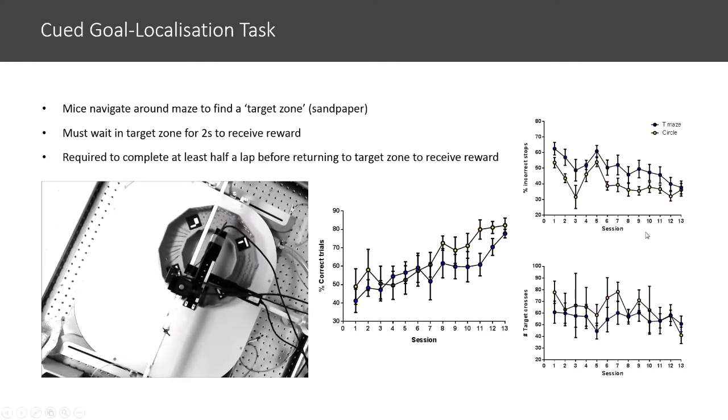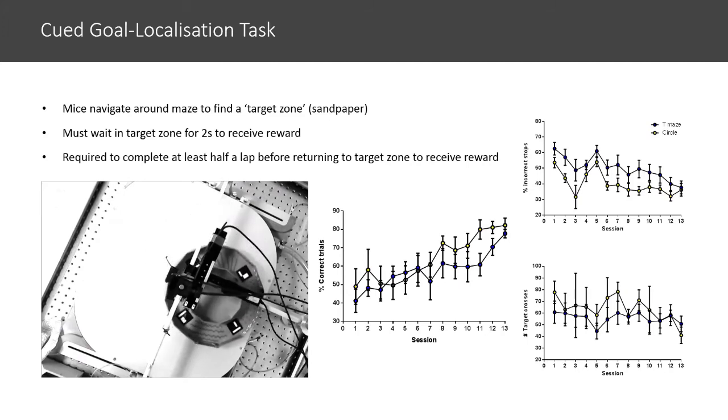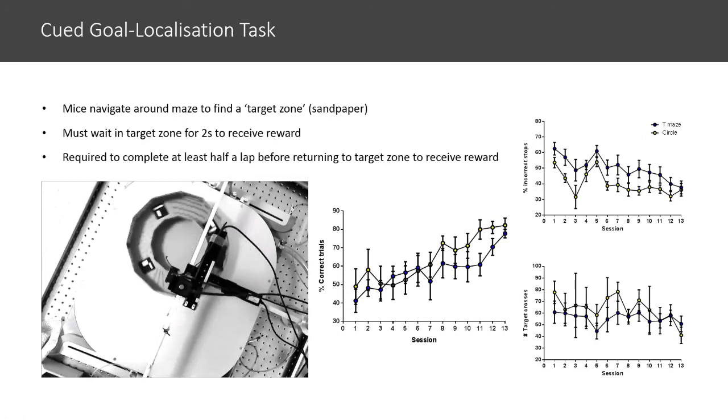And you can also see that over time, they show a reduced tendency to stop in other non-target locations, whilst their overall activity remains pretty consistent across the sessions. So this tells us that in a fairly short space of time, these head-fixed animals are able to effectively learn to respond appropriately to a cue in order to obtain reward. And we're using behavioural tasks like this to form the basis of our experiments, investigating the neural mechanisms underlying spatial navigation and memory. So it's at this point that I'll hand over to my colleague, Jon, who's going to talk more about the process of getting intracellular recordings in the mobile HomeCage in this task.